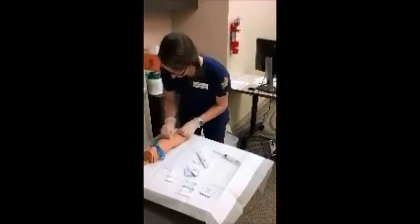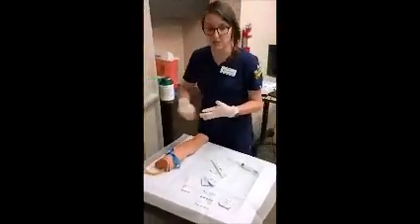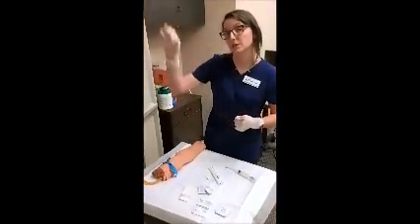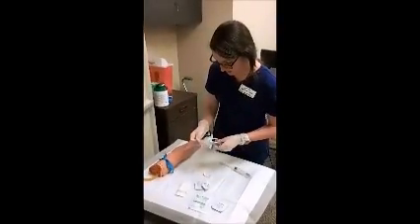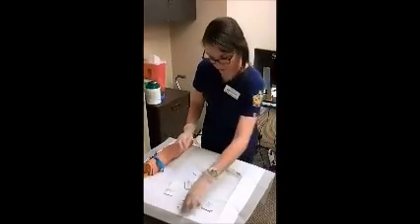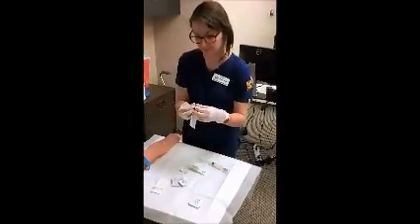Get it real good and clean. Usually when I do this, I'll scrub. I'm used to having patients that tend to have dirtier arms. I'll scrub with one alcohol swab, and then I'll do the circular motion with the other alcohol swab. So now that that is getting good and dry, we'll go ahead and leave that in there. We can open our gauze first, because that alcohol's still drying a little bit.